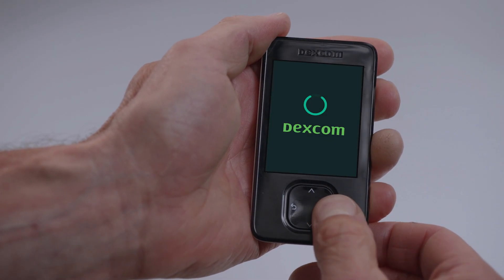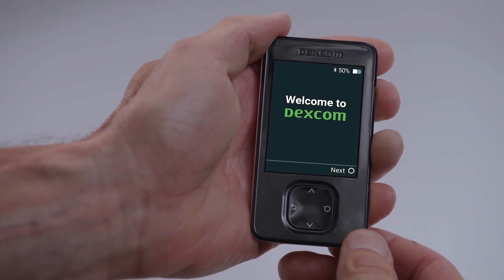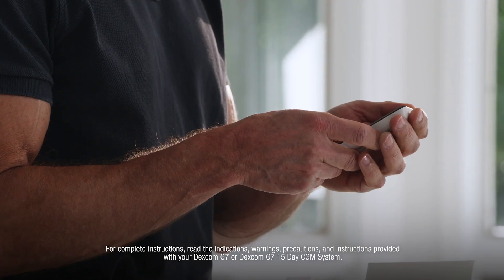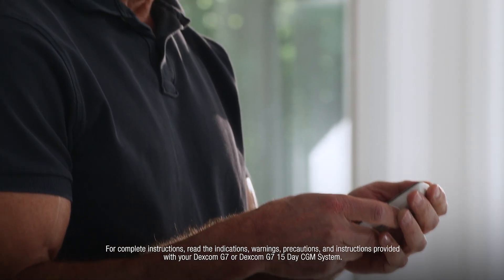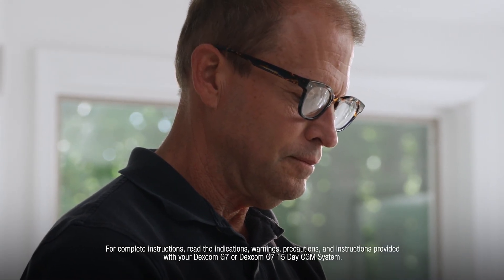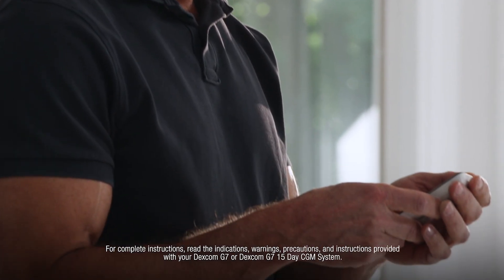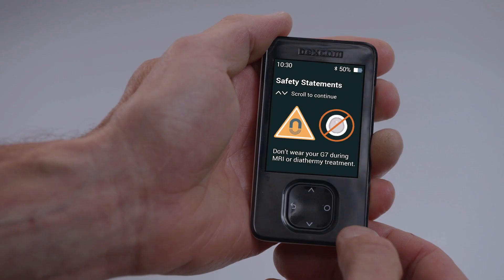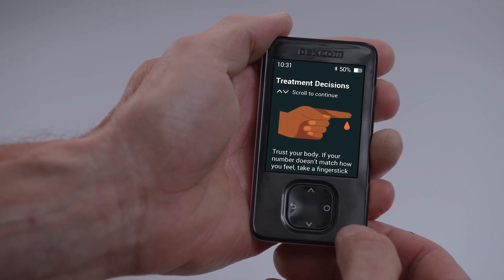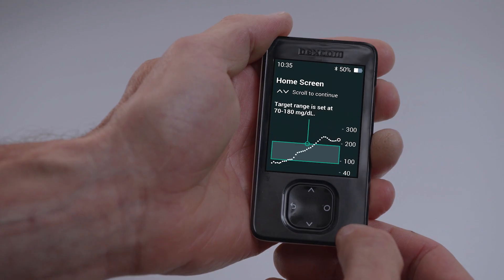The receiver walks you through the entire setup process step by step. Select next to continue. First, you will accept the Dexcom Terms of Use and Privacy Policy and set your date and time. Then the receiver walks you through a series of educational screens. This in-receiver mini tutorial will teach you all about safety, treatment decisions, trend arrows, alerts, and reading your home screen.